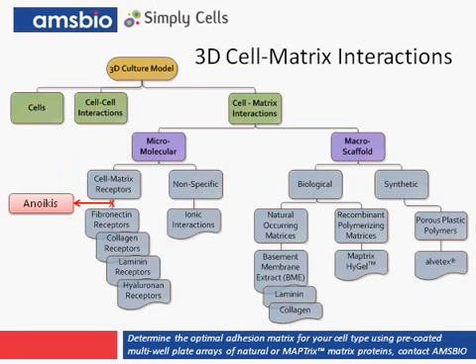Again, here we have micro and macro interactions. The molecular interactions may be nonspecific through ionic interactions. However, this is of little biological relevance. Charged tissue culture surfaces are typically important for the adherence of the extracellular matrix, not necessarily cells. Which brings us to the specific molecular interactions directed by the cell matrix receptors.